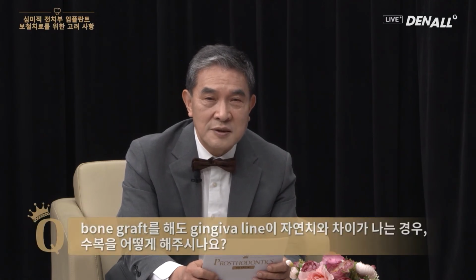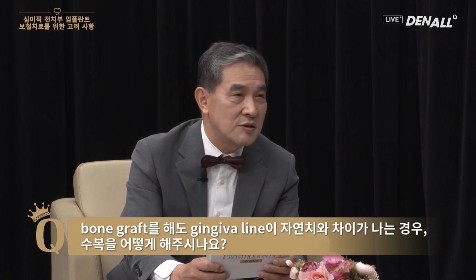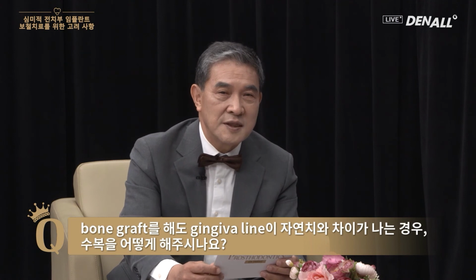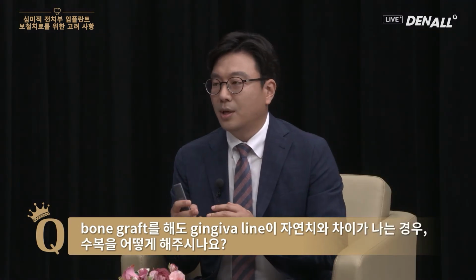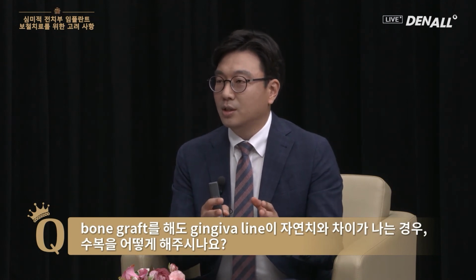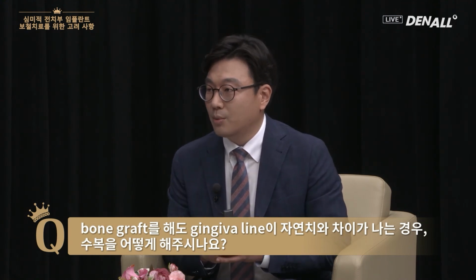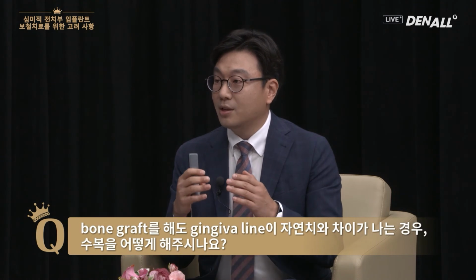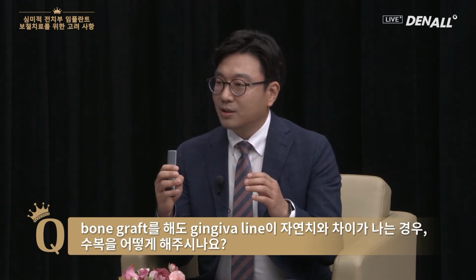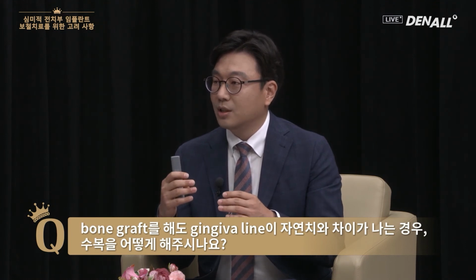In real time, we received some questions. With the bone graft, if the gingival line is different from the natural teeth, how do you restore? After bone graft, we usually do two-stage surgery. In the second surgery, CT graft can be used to address it surgically. Still, if there's a discrepancy, the ideal gingival level should be found, and the natural tooth can be adjusted. The gingival line of the natural teeth can be modified?